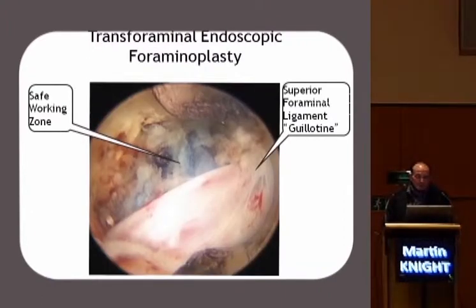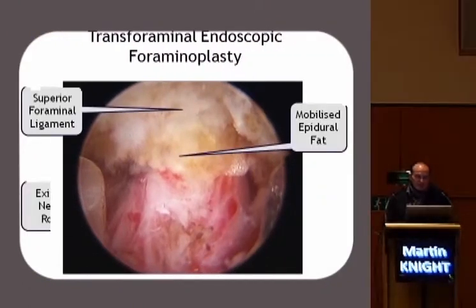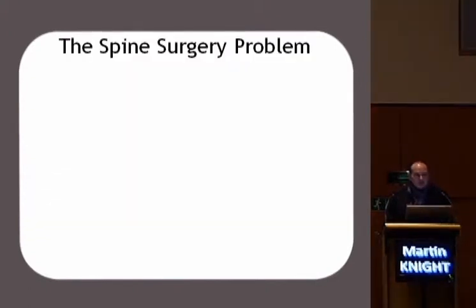So when you have done the clearance, this is the sort of vision you'll get. You'll see the blue here — it doesn't mean that I'm operating on royalty. It means that we put a blue dye in the disc to define the annulus, and it also shows which bits of the annulus are particularly thin. You'll see here that the nerve has been mobilized from the disc. There's your superior foraminal ligament and the inferior pedicle down here. I've turned the endoscope through 90 degrees. It shows how incredibly red and inflamed the nerve can be. I'm pleased that epidural fat was now coming through under the resected superior foraminal ligament. That fat will protect the nerve over the longer term.